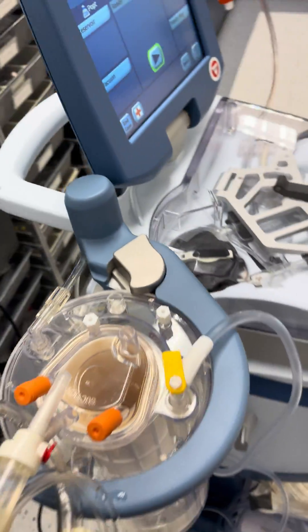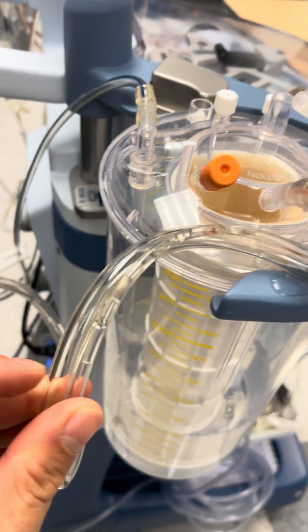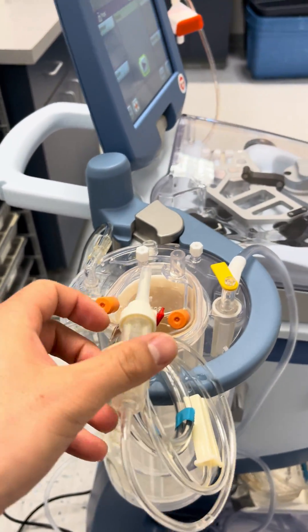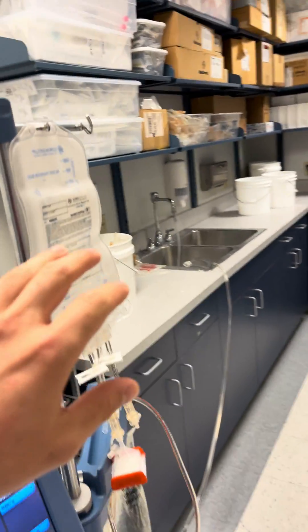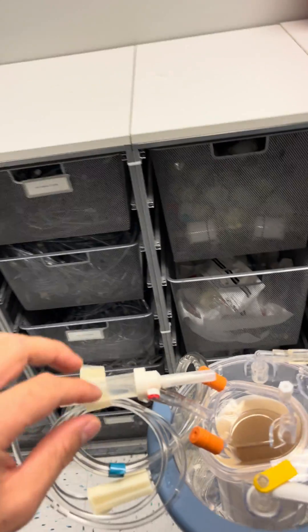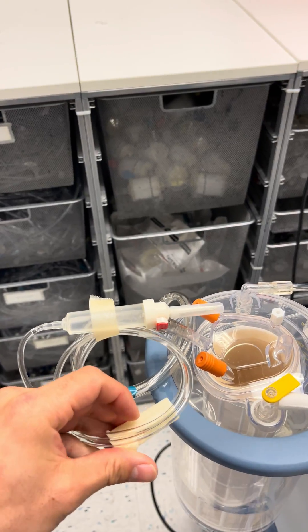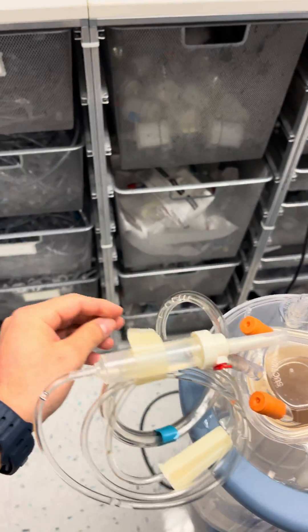With the aspiration tubing, there's a big line where the blood comes in, and then there's a small line attached to it — that's where the heparin gets spiked. So the heparin is going to be spiked with this little spike right here. You'd have your heparin bag hanging here, and you'd spike it so that you have heparin constantly mixing with the blood volume coming in — you can adjust the drip rate for that.